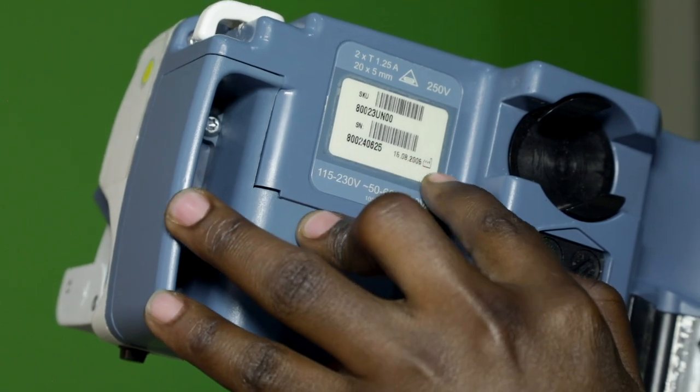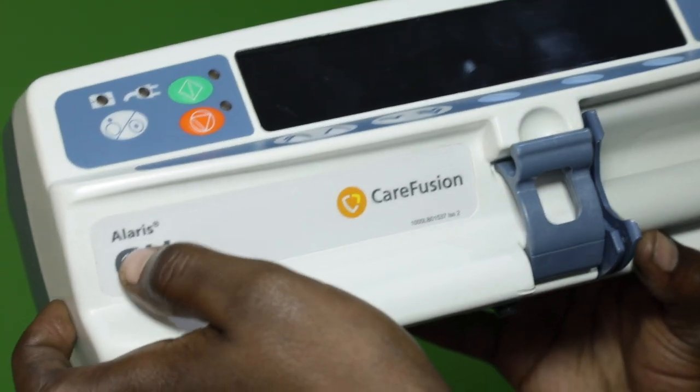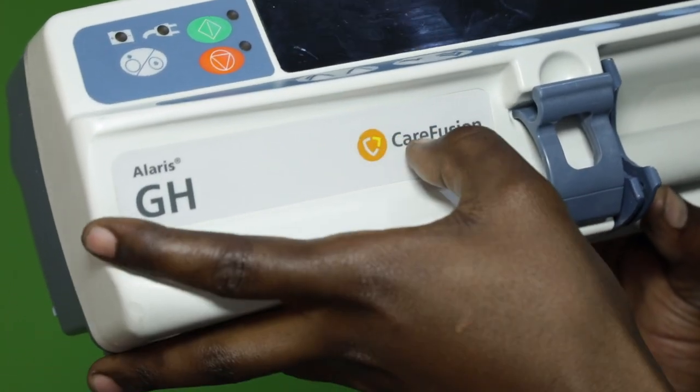Nous allons vérifier que toutes les inscriptions sont lisibles sur les étiquettes, telles que la marque, le modèle, le numéro d'inventaire et les consignes d'utilisation.